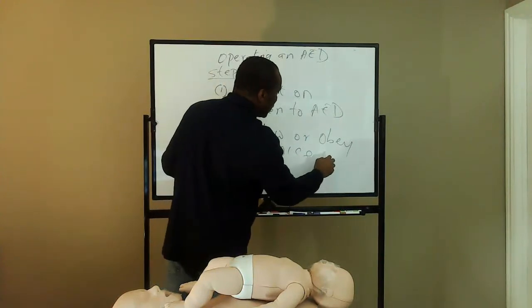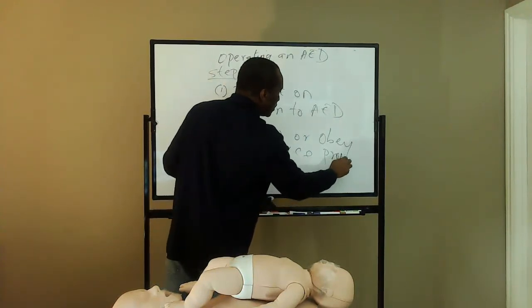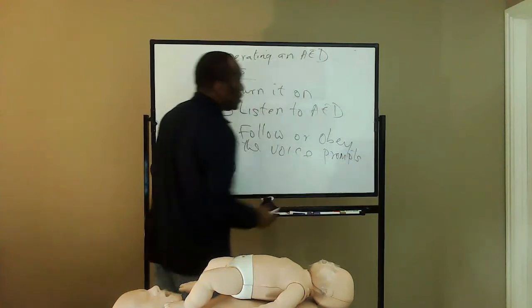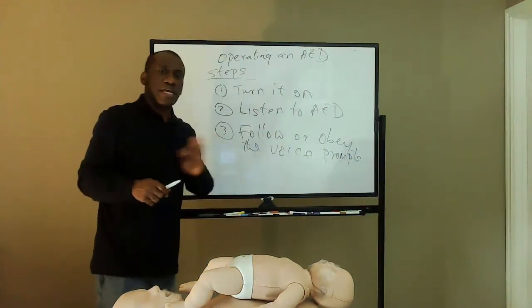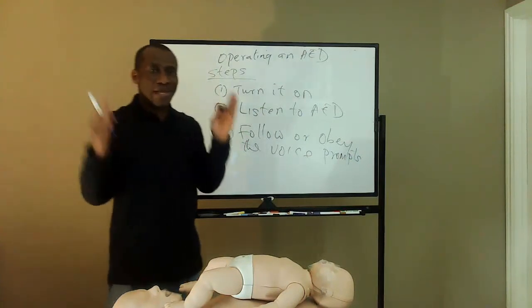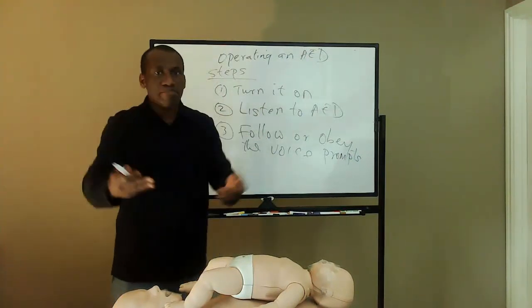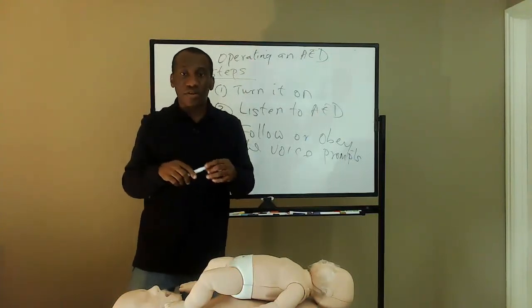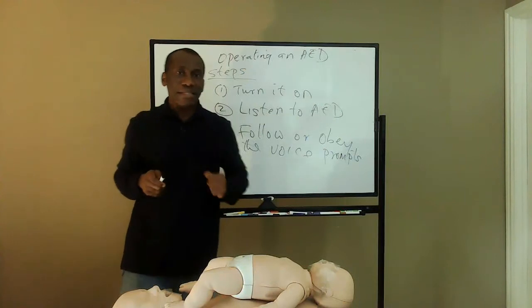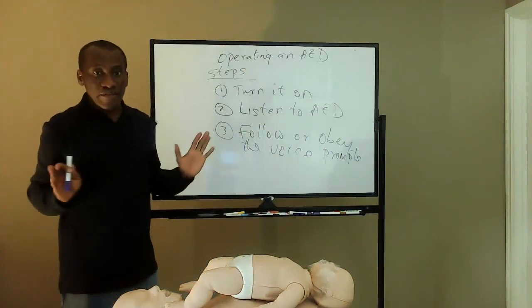Obey the AED voice prompts. So it begins to talk. Just follow. You don't need to question the AED. You don't need to argue. The AED doesn't need your input. All you need is to carry out the instructions in the order that the instructions are given.